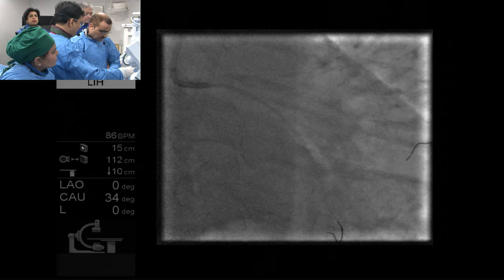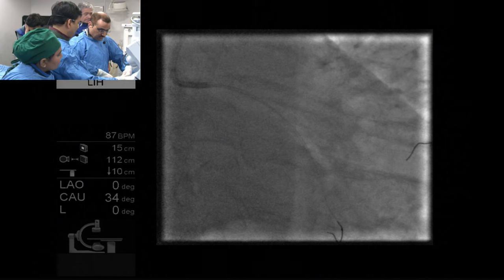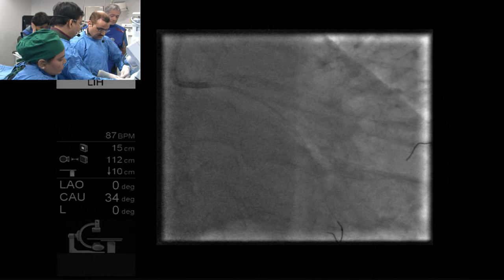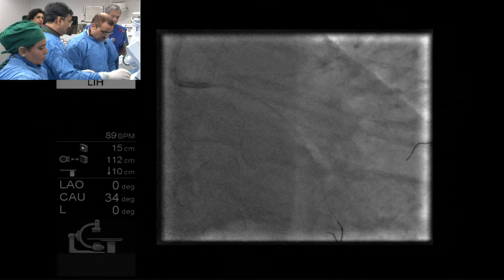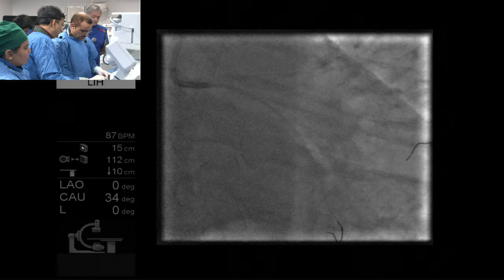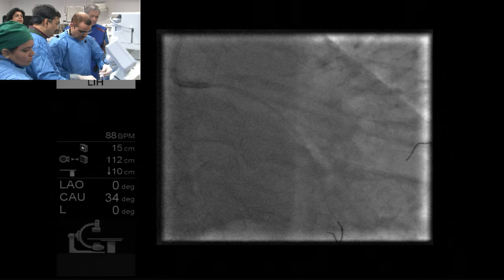If you put the stent alone and then take a new balloon, it'll probably work out. Hold on. Just get this one because this was the other way, right? This is circ. Proper circ. We had a circ first. Let's see this one, what happens. But circ, I had a first one. So put it this way.